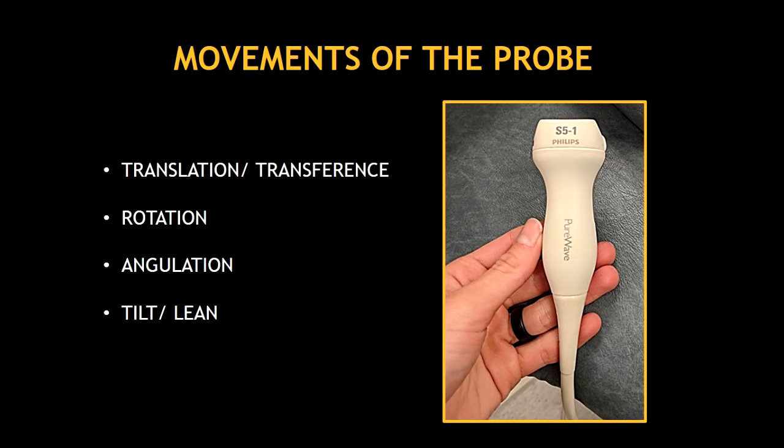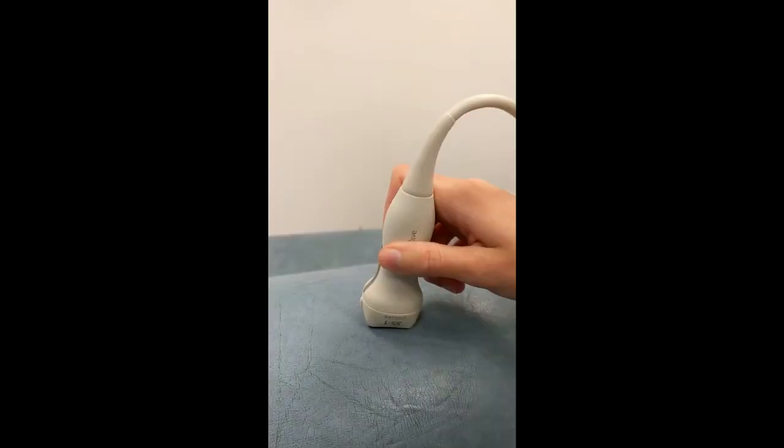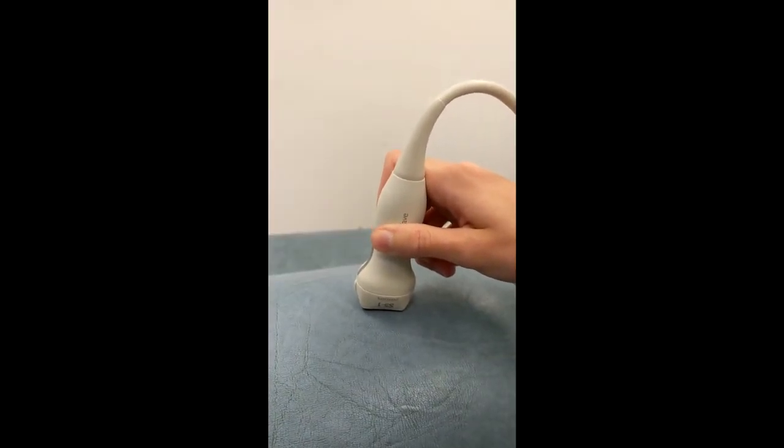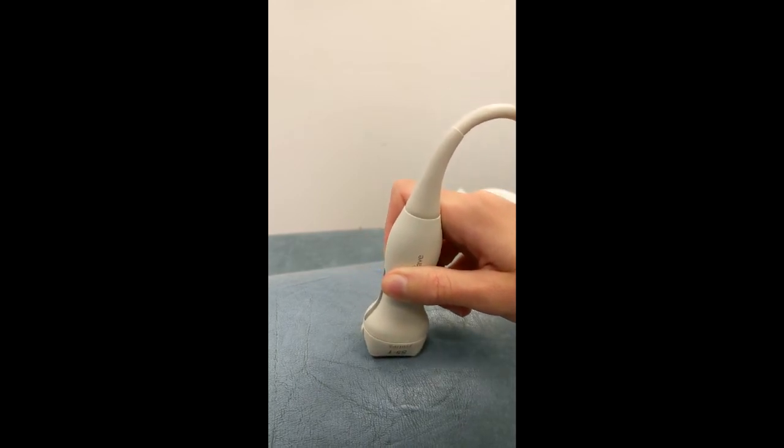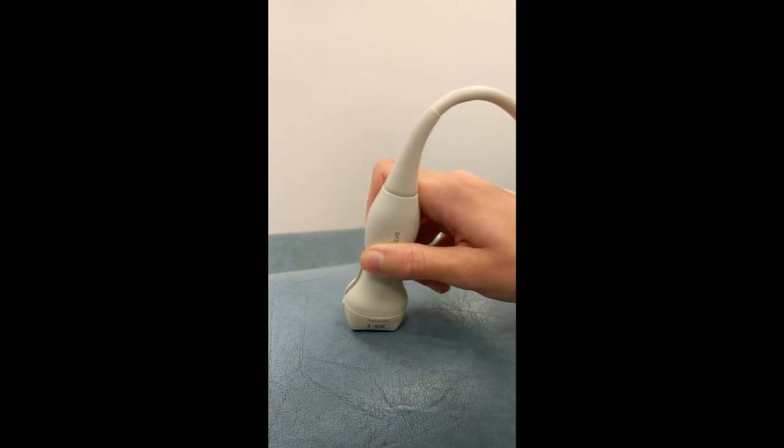I'm going to describe now one by one each movement and it's going to be followed by a video. Translation or transference is when you move or transfer the probe to another area on the patient's chest in any direction. In this video I'm translating the probe, which is moving the probe from one area to another one without doing any other movement.